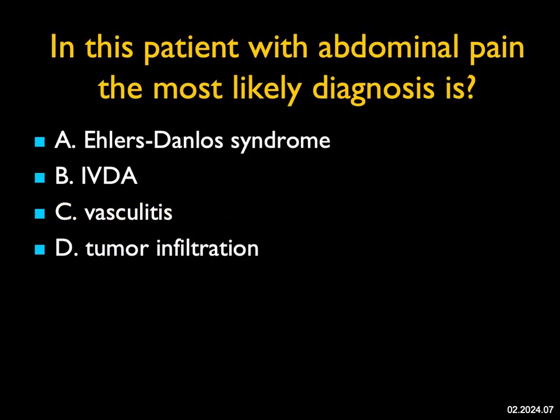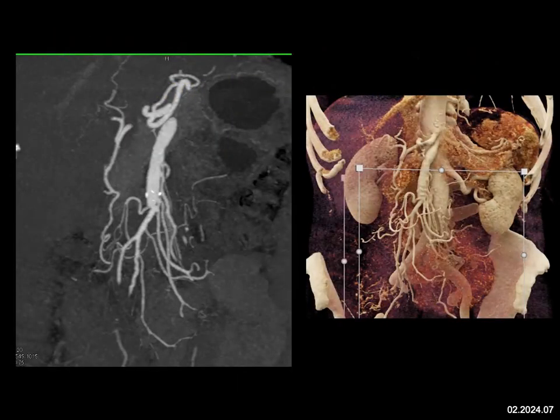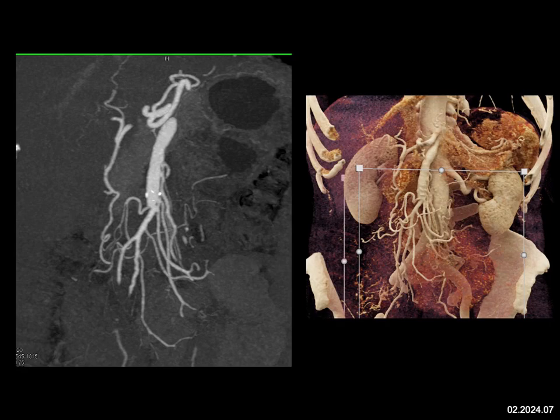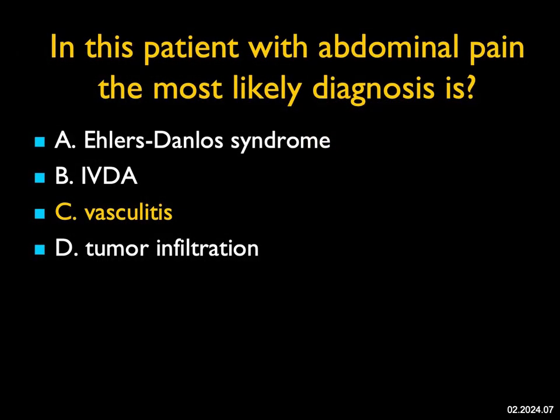In this patient with abdominal pain, what do we see on the MIP and the cinematic rendering? We follow the patient's SMA downward and it's irregular. Then you see all of these unusual branch vessels with slight beading in some of them off the patient's SMA. Ehlers-Danlos can give you aneurysms but not this beading. IV drug abuse can give a vasculitis appearance. I don't see a tumor here. The most likely diagnosis is vasculitis — a large vessel disease. This ended up being worked up further and was giant cell arteritis.